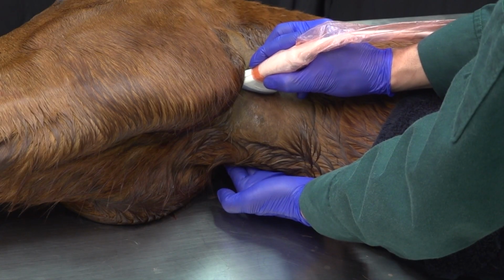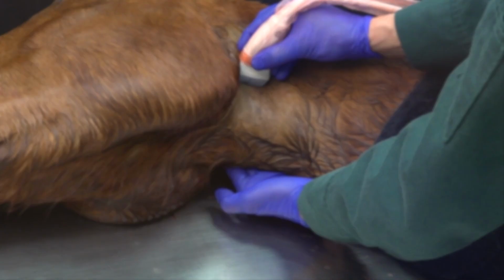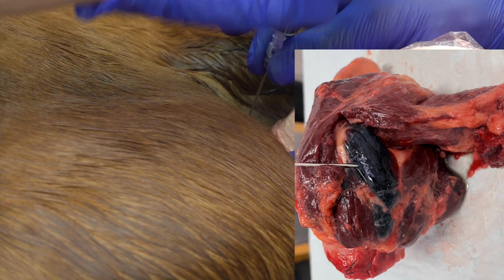We first tested this technique on cadaver larynges. On ultrasound, the CAD muscle appears as a moderate echogenic muscle positioned just dorsal to the arytenoid cartilage. We injected 5 milliliters of methylene blue into 5 cadaver larynges. In all cases, the dye was visualized within the CAD muscle.